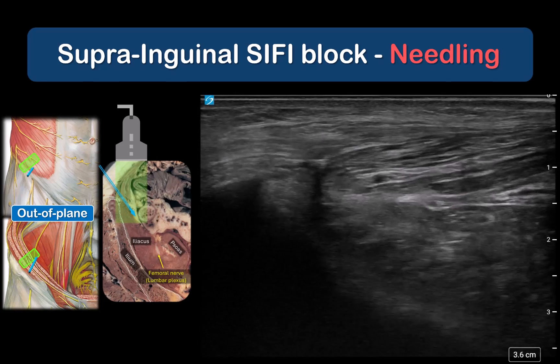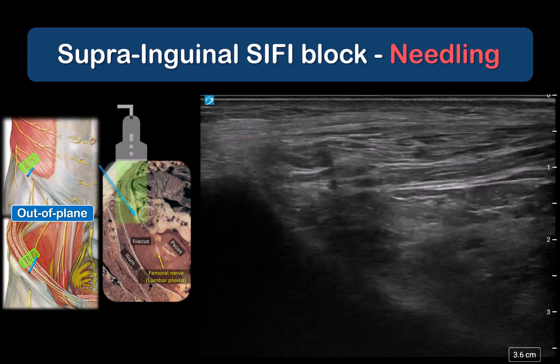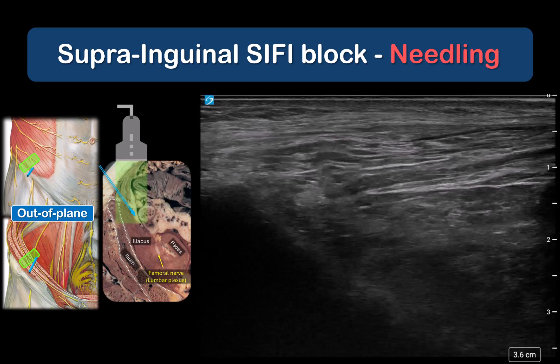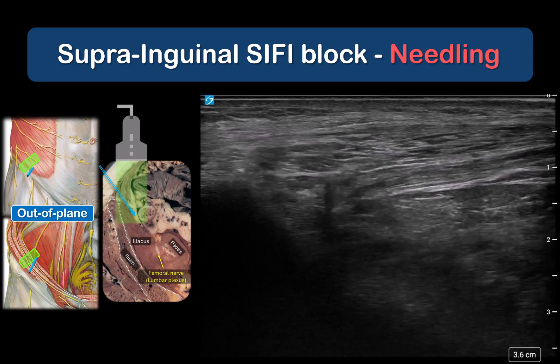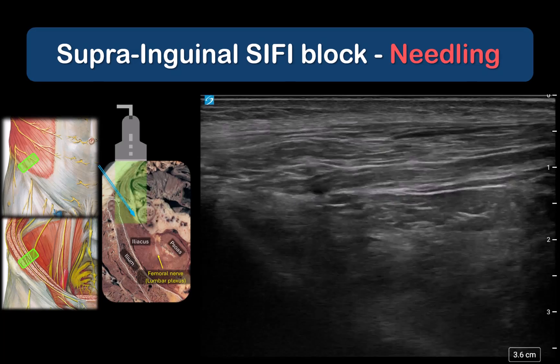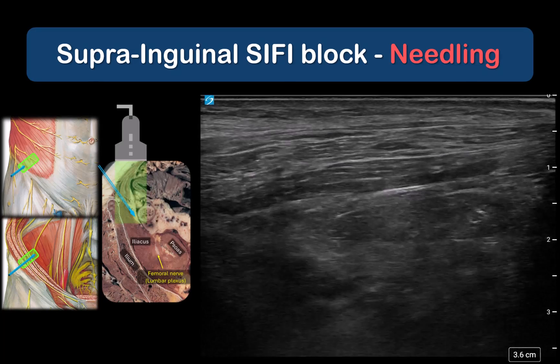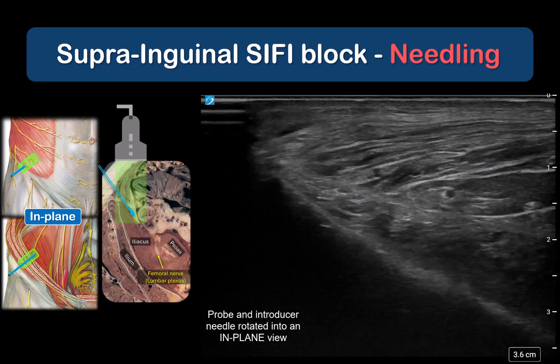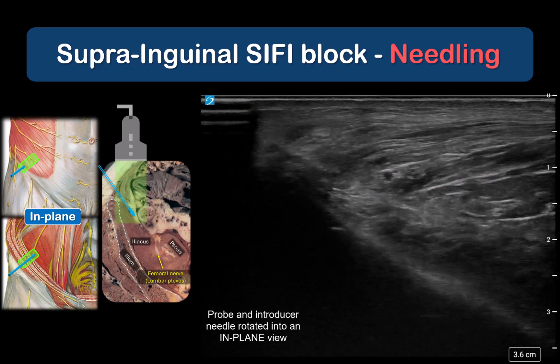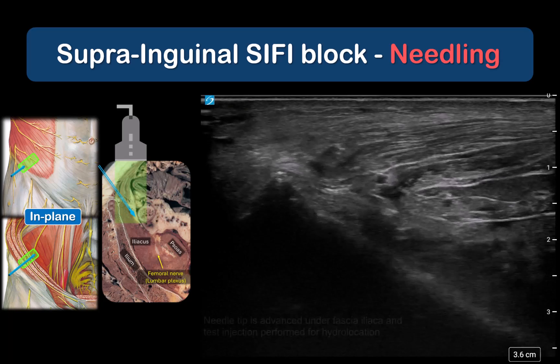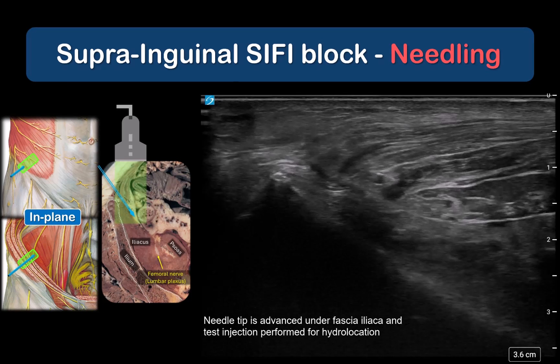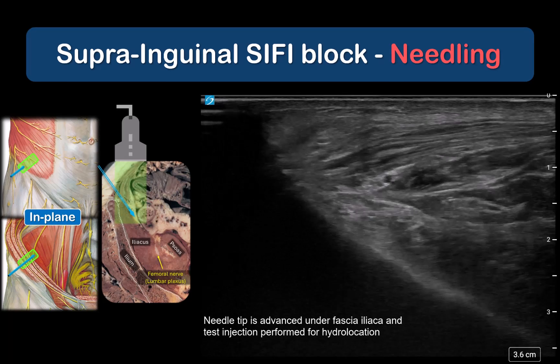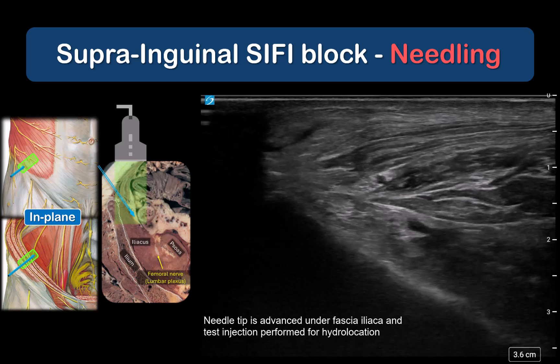Advancement through the musculofascial layers is guided by tactile pops and visual imaging cues. Once the needle tip has reached fascia iliaca, the probe and needle are repositioned to achieve an in-plane view. Placement of the needle tip under fascia iliaca is confirmed by hydrolocation with half-mil test injections of local anesthetic.